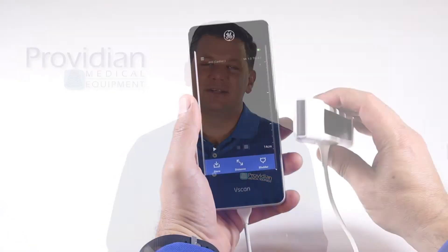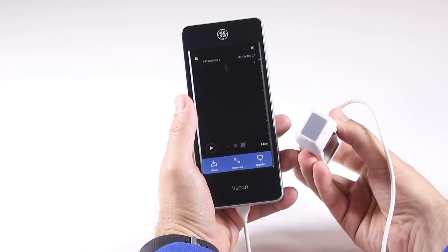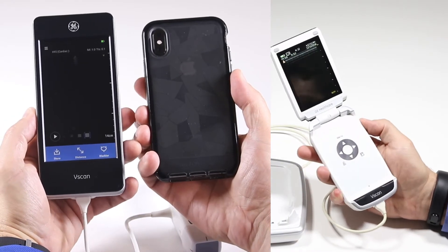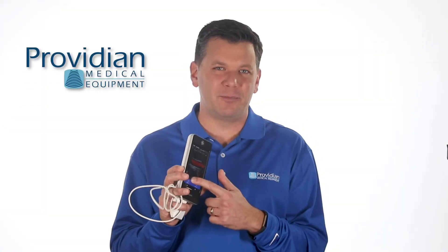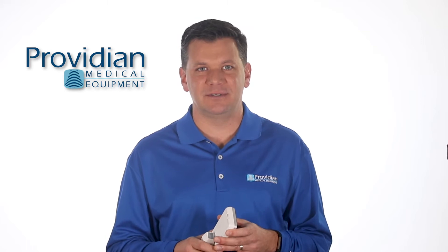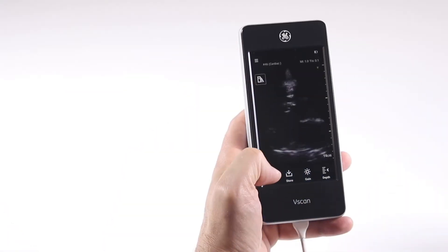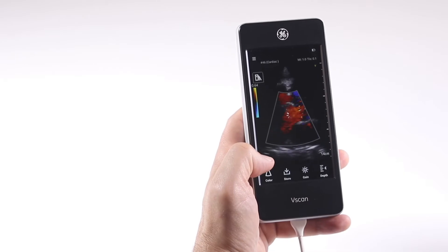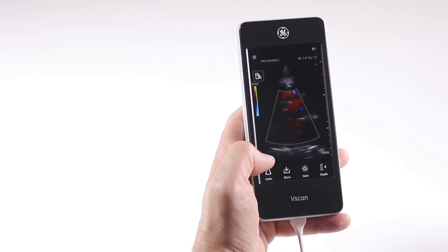This is the third generation of the GE vScan lineup. The Xtend is larger, has a new interface with touchscreen controls, downloadable apps, Wi-Fi, and a much larger screen than its predecessors. It has good frame rates, but it's not the fastest when changing imaging modes — though when you're just talking about a few seconds, it's really not a big deal and won't slow you down.